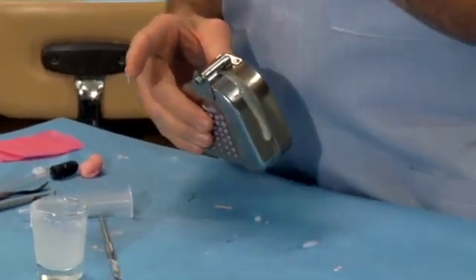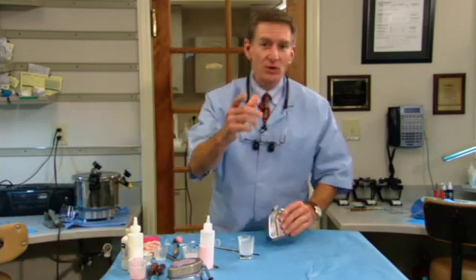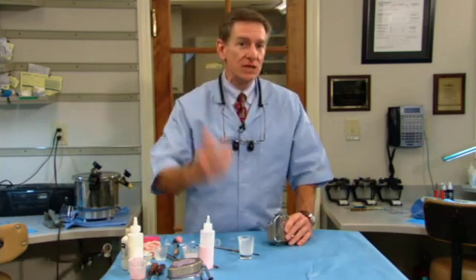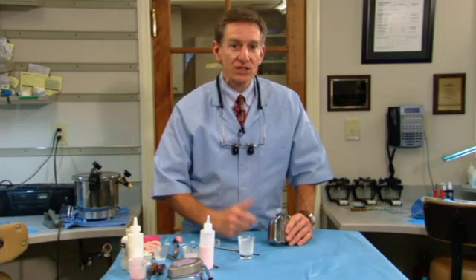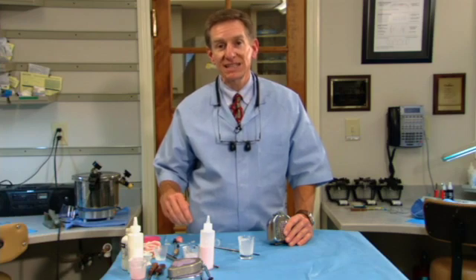Hey, let me show you something else you can do with a clear duplicate. Now this is cool. Suppose you had a patient that you wanted to make a new denture for. They lost their denture, they broke their denture, or some teeth have broken, or they've worn out. An easy way to make a new denture for a patient is to make a clear duplicate of their existing denture or their old denture.